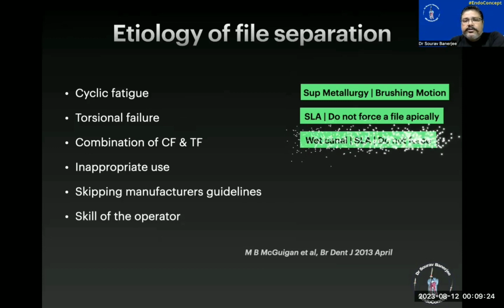Now, for a combination of cyclic fatigue and torsional failure, we have to avoid both of the things that we mentioned earlier. Second, we should always work in a wet canal, never in a dry canal, use straight line access, and again, do not force a file.